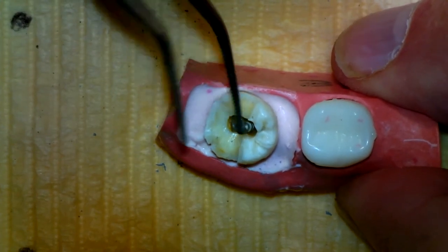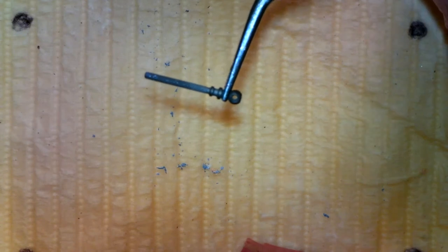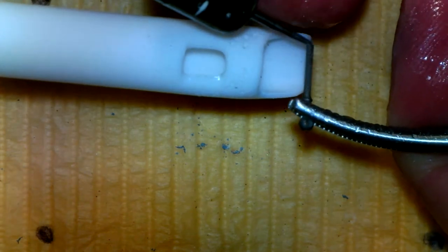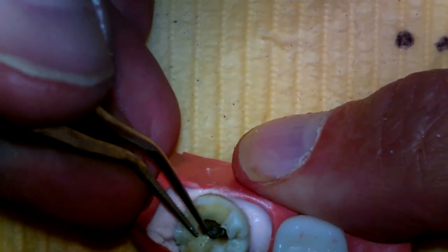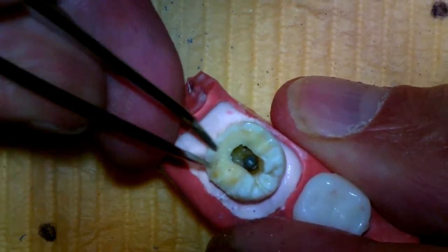It goes as deep as it can go, but it's sitting a little high. I'm going to take a little bit off the end of the post using the high speed — cut about a millimeter off the end and round it so it's not too sharp. Now putting it back in, it goes deeper and nicer into the canal, down to the orifice. We'll be using that.